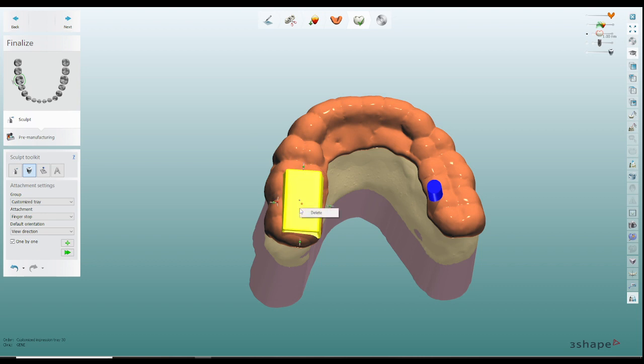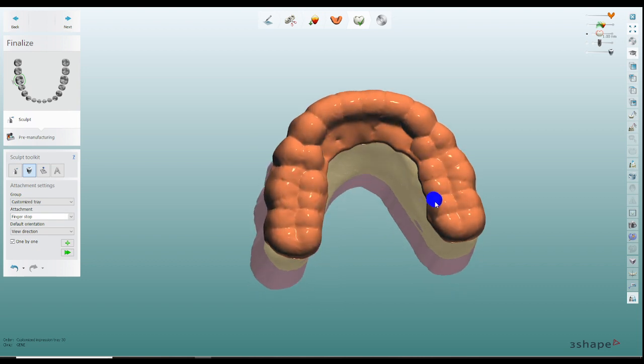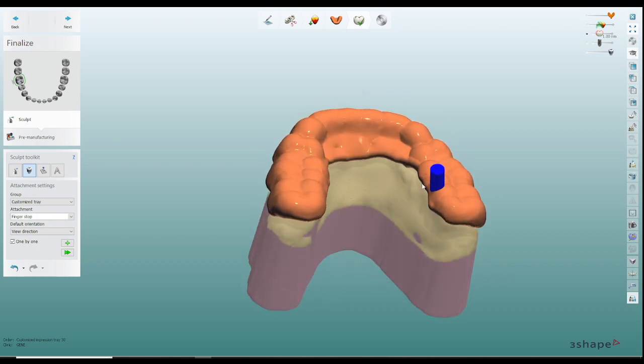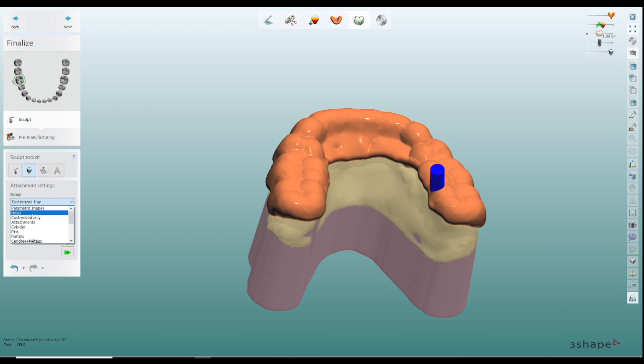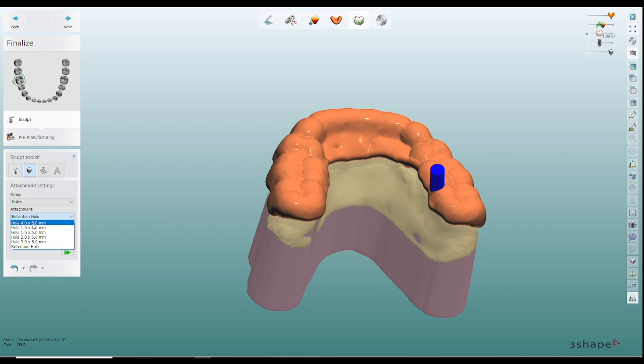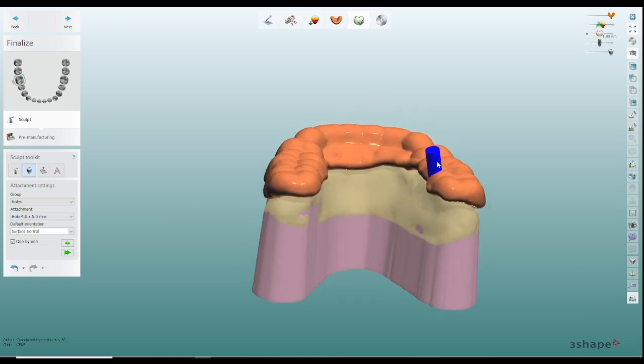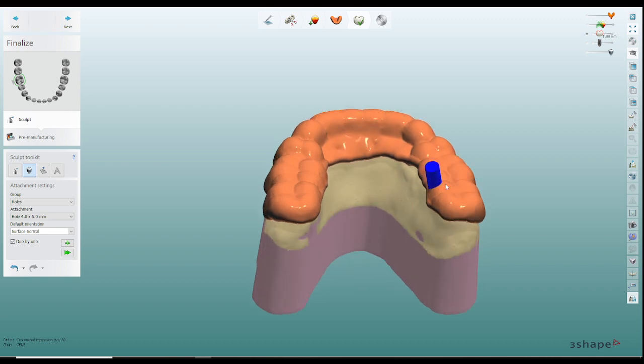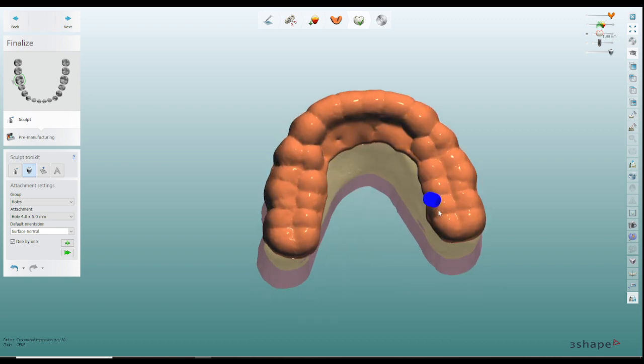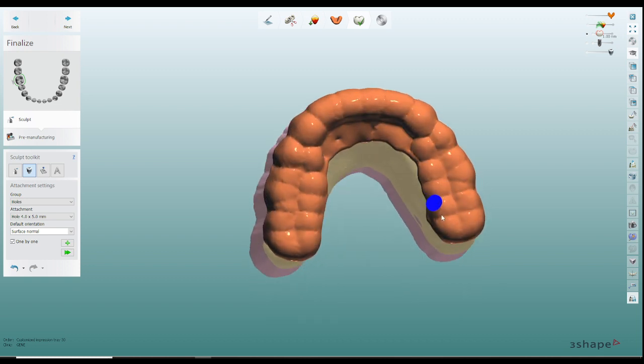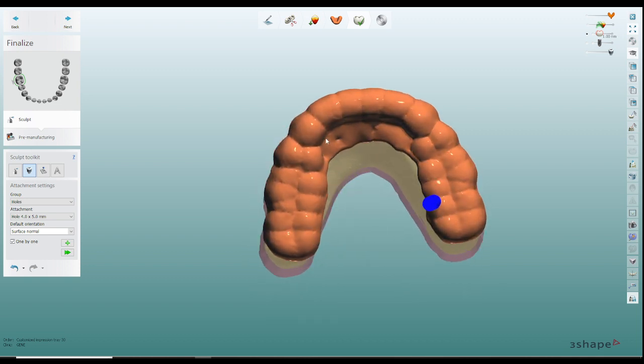Let me just erase this here. So what I do is I go into the menu here on this side and I choose holes and I choose four by five. So it's going to be four millimeters in width and five millimeters in length and you can see I placed one right here.